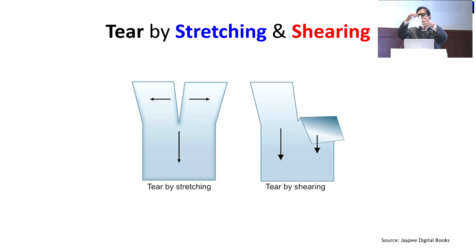Now, if this is my right hand, my capsule is running away. This is my stable part, the peripheral part of the capsule, and this is my leading edge of the capsule. So I have done this, I have now flattened it, and I pull. It is going to come this way. You can do this again. Sorry, this is a little too much. Go back home and try it. It moves very predictably every time.